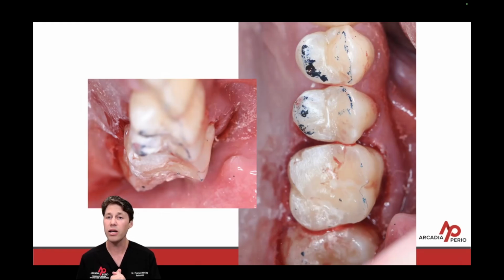And I'm going to do heavy occlusal adjustment. In this case, I'm actually going to take this tooth out of occlusion because I want to completely eliminate the traumatic forces. So as you can see here, the tooth is out of occlusion. And now when it comes to the occlusion, we're going to grind it low and let it grow, right? I've got to see what's going to happen. But if I don't control for that etiology, I won't get the ideal osseous regeneration. So in terms of the LANAP protocol, occlusal adjustment is key to success with these cases.